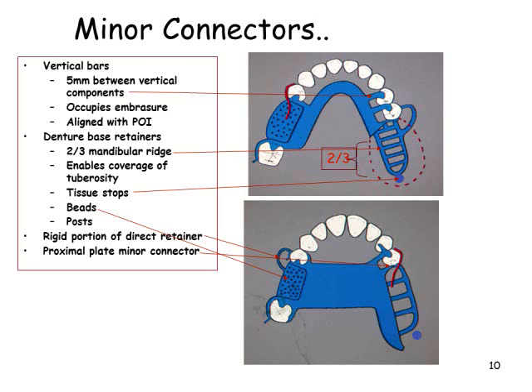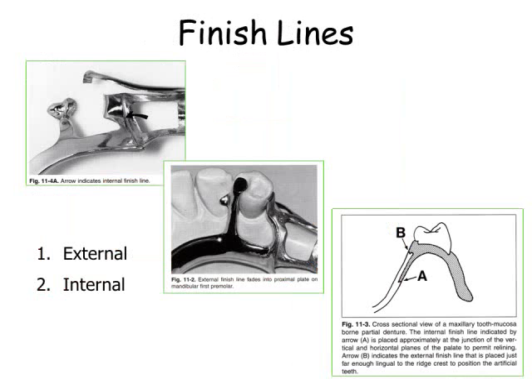Minor connectors for maxillary distal extension denture bases should extend the entire length of the residual ridge, and should be of a ladder-like construction. The finishing line junction with a major connector should take the form of an angle of less than 90 degrees, therefore being somewhat undercut. Of course, the medial extent of the minor connector depends on the lateral extent of the major palatal connector. Too little attention is given this finishing line location in many instances.